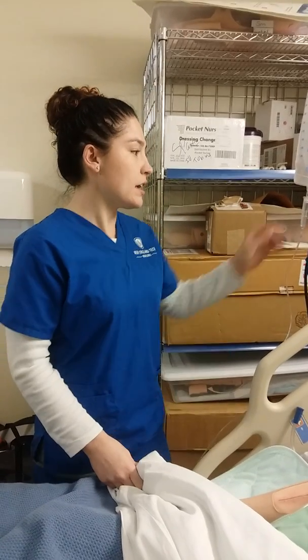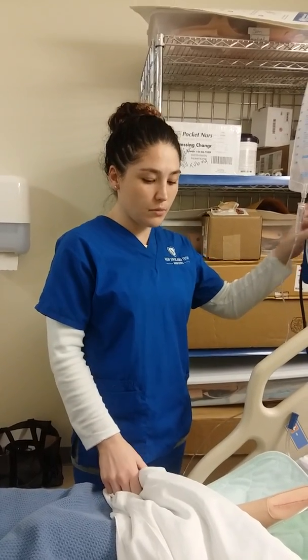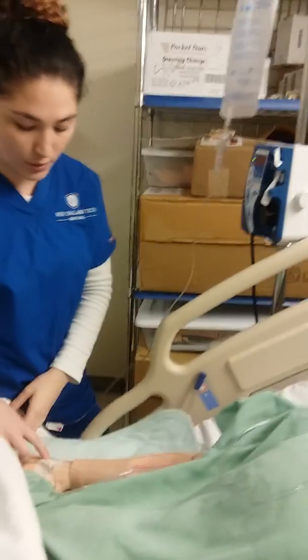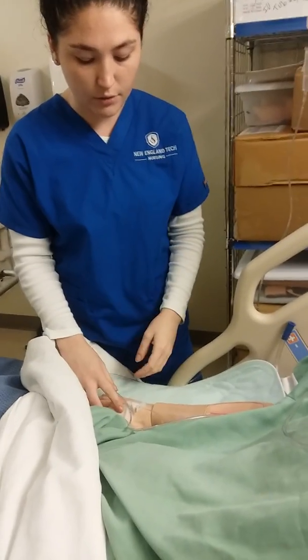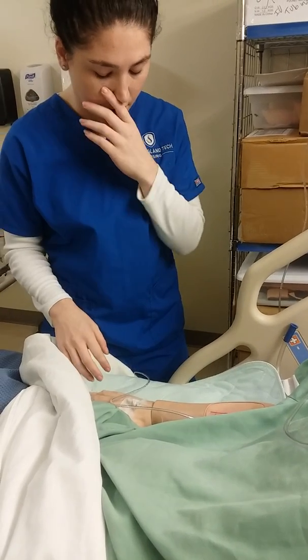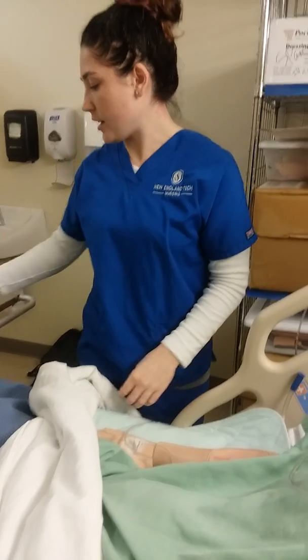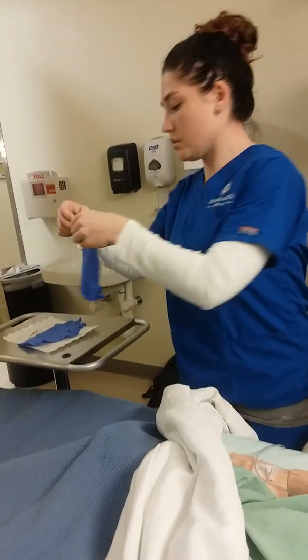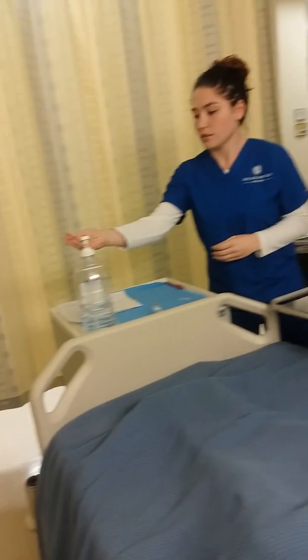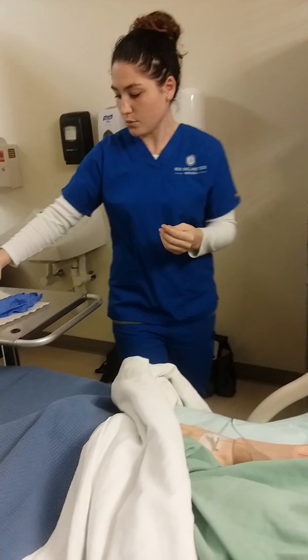And then at this time, I would pause the IV infusion pump, and I would assess the site for any swelling or infiltration or inflammation. Making sure that the patient is okay with administering the medication. And then I would put on gloves after I would perform proper hand hygiene. Put on gloves.